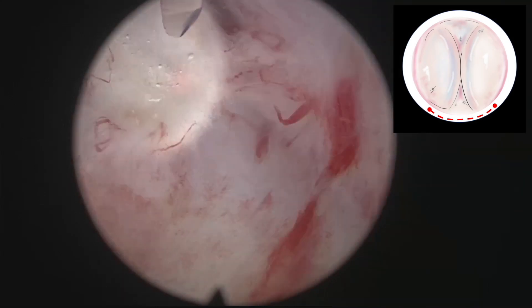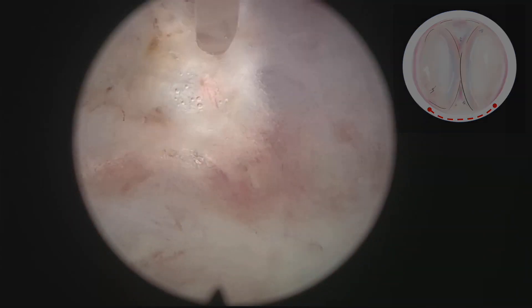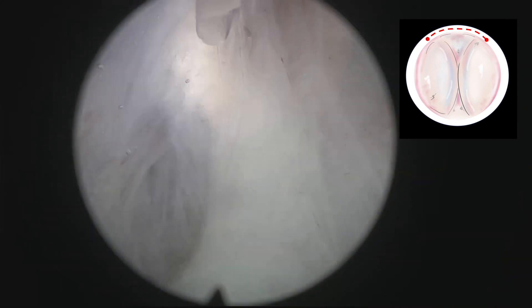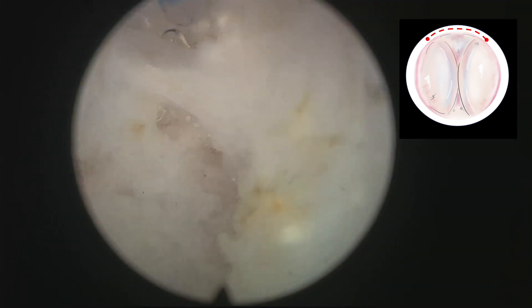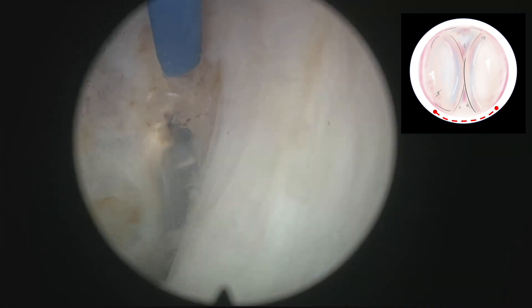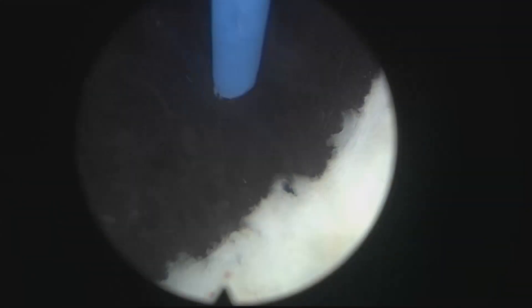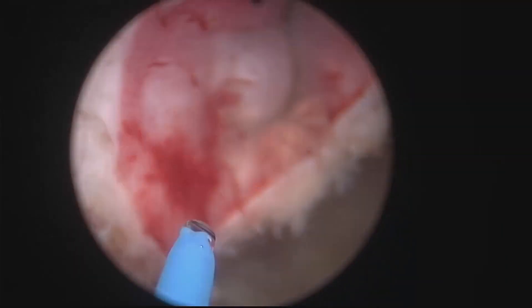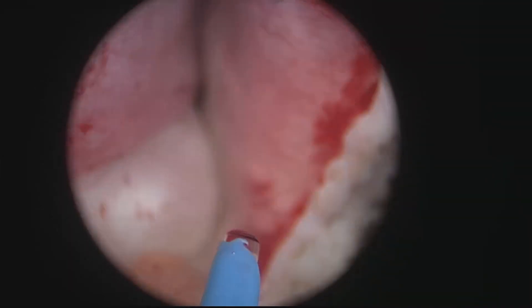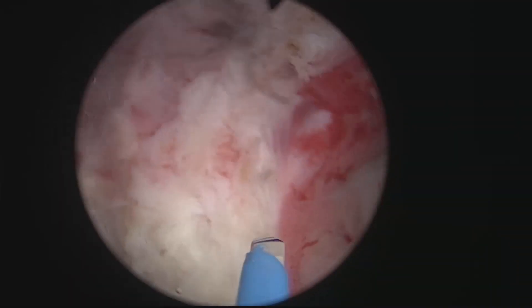Again, despite the look of a nice deobstruction on the left side, we followed the anatomical plane to perform a total en bloc enucleation of the prostate. It is very striking to see how much tissue was left in this case, and very satisfying to be able to remove everything. This en bloc approach provides very good irrigation and very good visibility, and this is the tissue that was left behind, now removed completely with this en bloc technique.